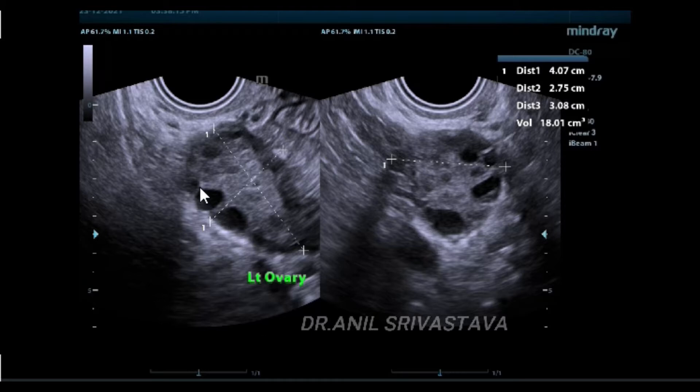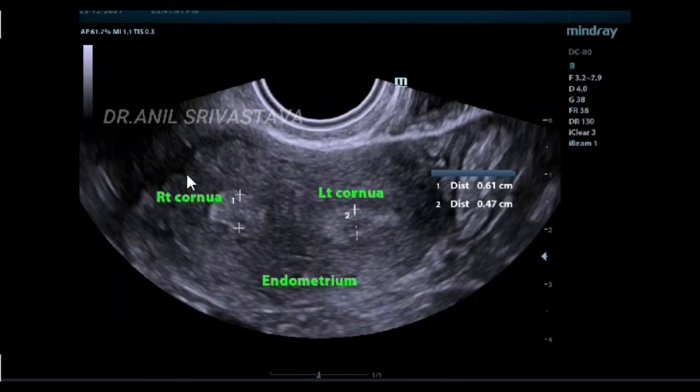This is the same LMP. This ovary is 18 cubic cc, having large follicles attached on the periphery — you can see them here.